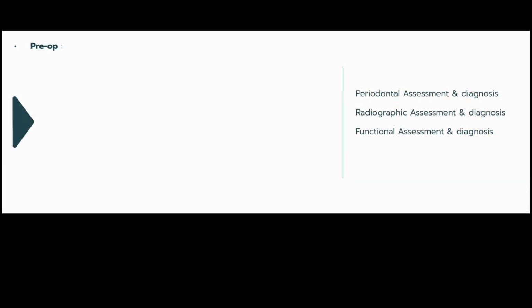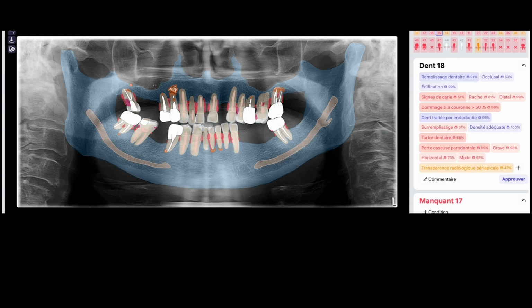We will do it as we always do for every patient. The idea is to go through the complementary examinations also. We will bring the photos, but you will also see the analysis of the diagnostic.